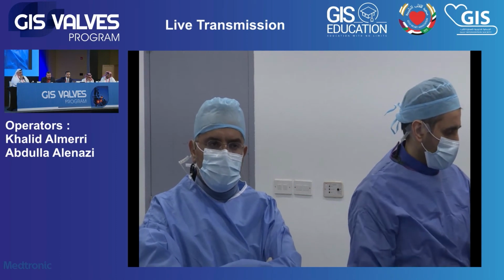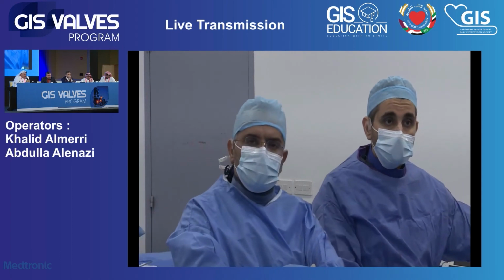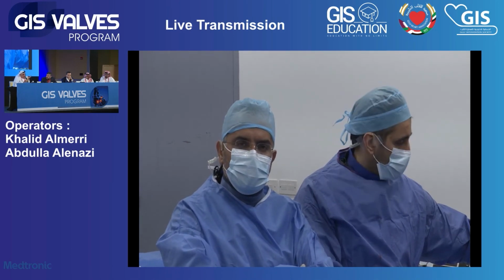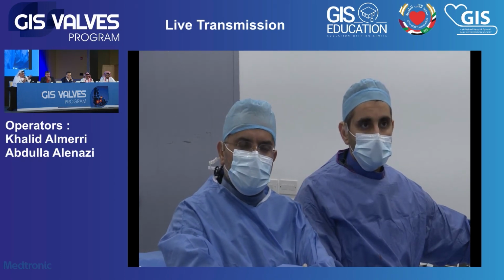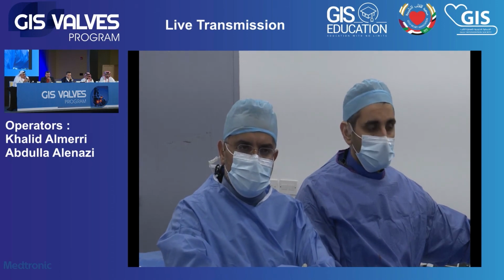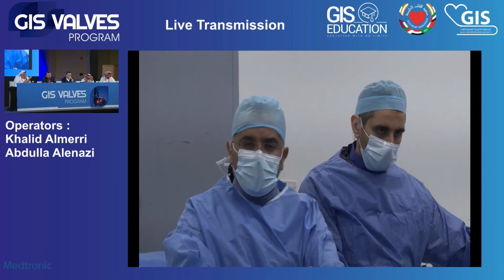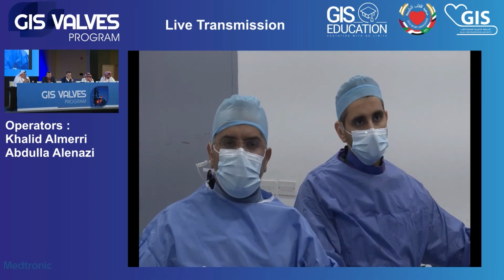And one thing, Khalid, I was discussing this matter with the surgeon in our house. I was thinking, is there any concern for the mechanical valve by placing the guide wire? I don't know which wire you have used. Was it Safari or Confida? First of all, which size did you choose: the small, the extra small, the large? We chose the Safari small.